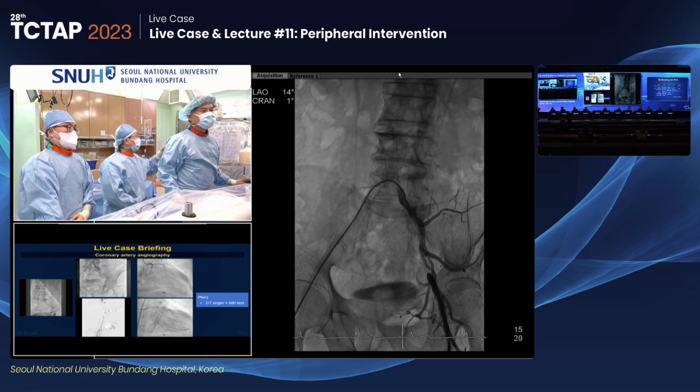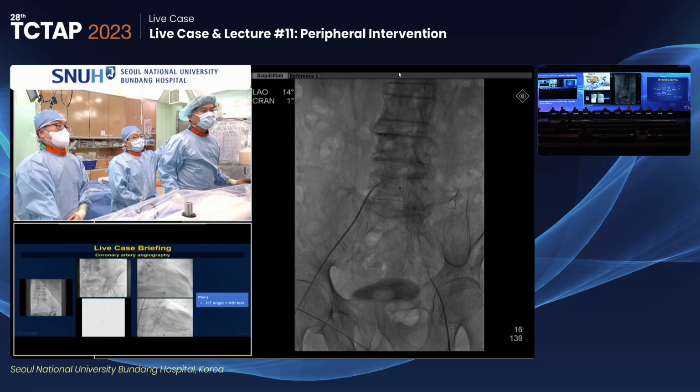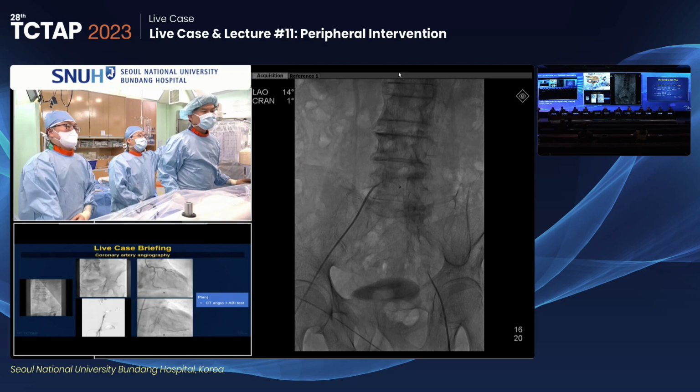So I decided on bidirectional wiring. The antegrade sheath is waiting, like a coronary CTO technique. I started with a multipurpose 5 French for support, and started with the 18 system, the Connect Flex 12 gram wire from Abbott.